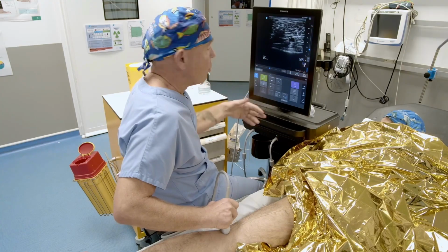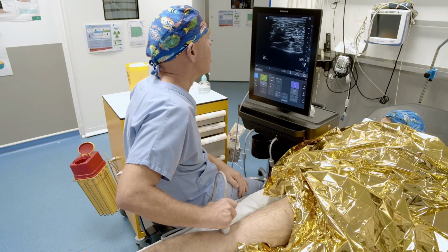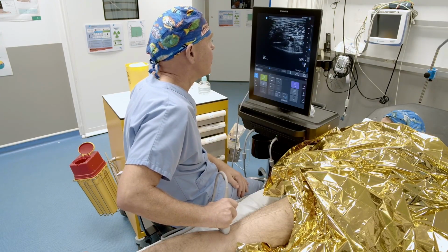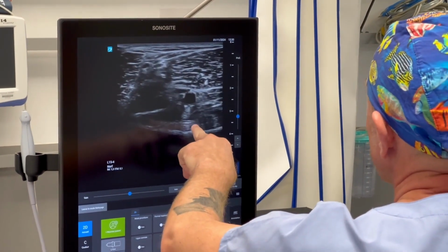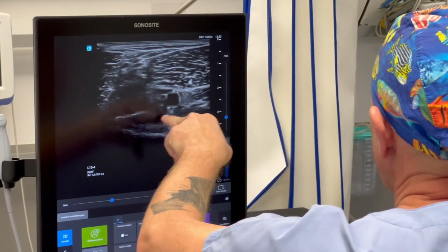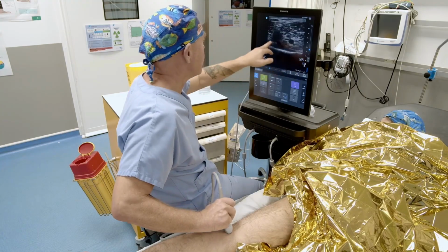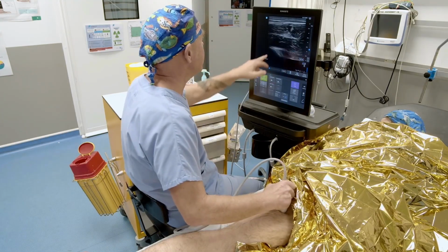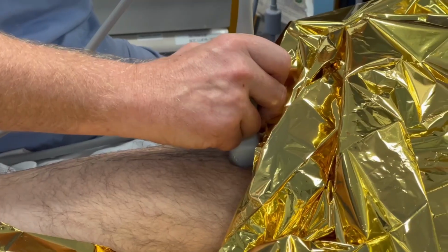the condyles. If you want to do an IPACK, I absolutely did not include this type of block in this version of the book, but the IPACK would be an injection under the artery, under the popliteal artery. It would be at this level along the condyles. So that's it for the sciatic block. You see, remember this image, the sciatic block via the subgluteal approach.